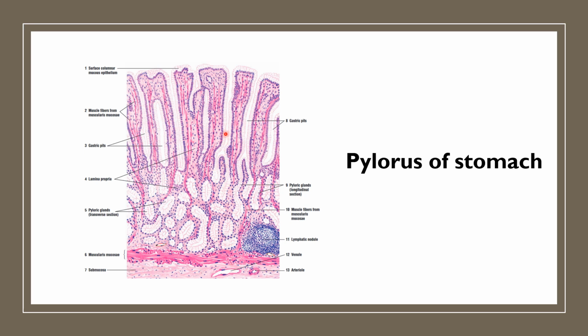So this entire thing is mucosa. So this is submucosa. The remaining layers are not given in this picture, but you can make out all the four layers there. Now you see this. So this is the mucosa. To identify this as your stomach, see for gastric pit. You are able to make out that gastric pits.